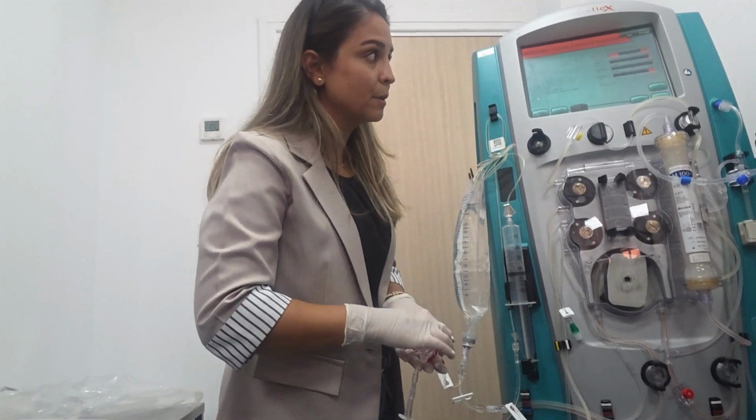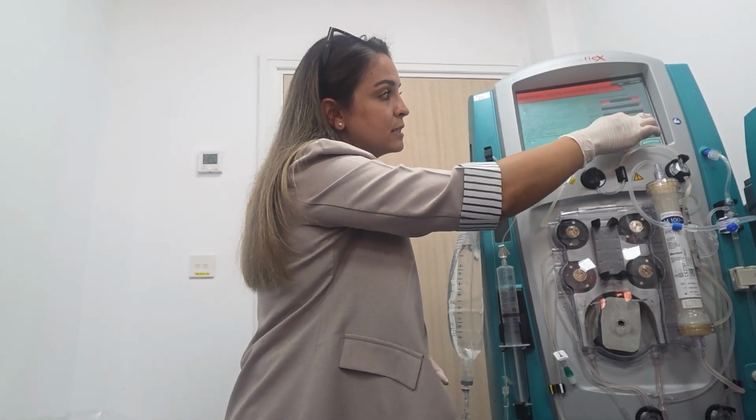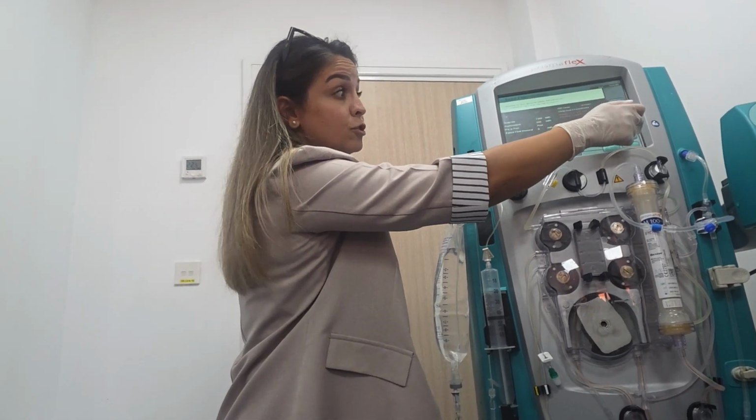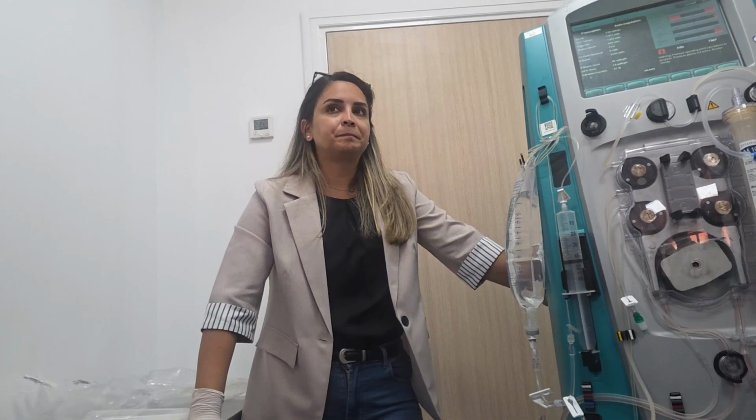See now, once I fix the problem, the pressure is back to normal, so we can press continue. The position of the catheter inside the veins, yes, also this will affect.